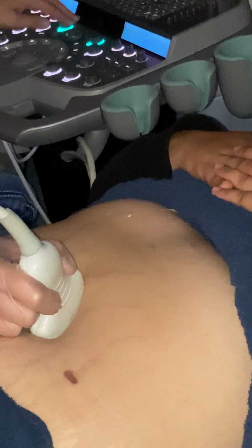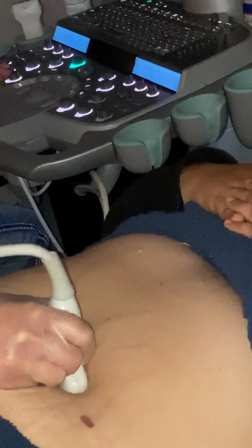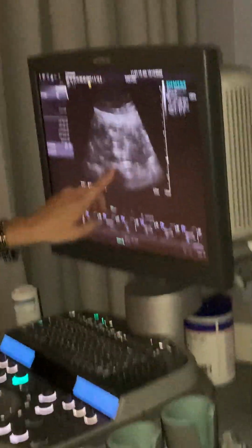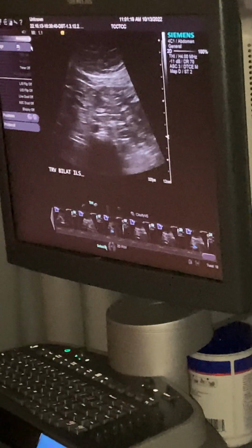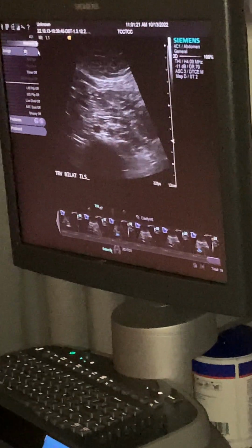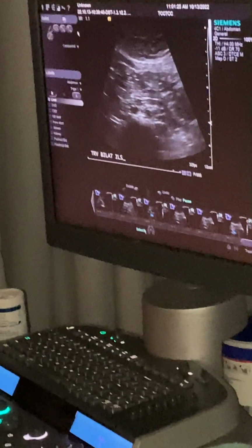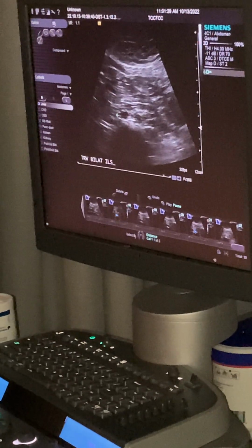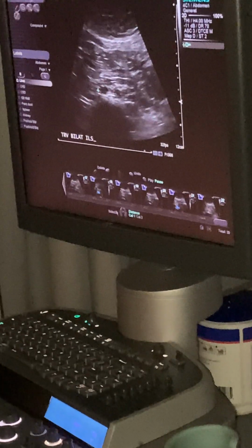That's going to be that little frog picture. Distal aorta, nice circular structure, come down, it starts to bifurcate, and we get these two little eyeballs of the frog face. We have two options here: we take our image and then we can just measure them on the same image. The only time we wouldn't want to do that is if one of them is going off the other way and oblique to what we're doing.